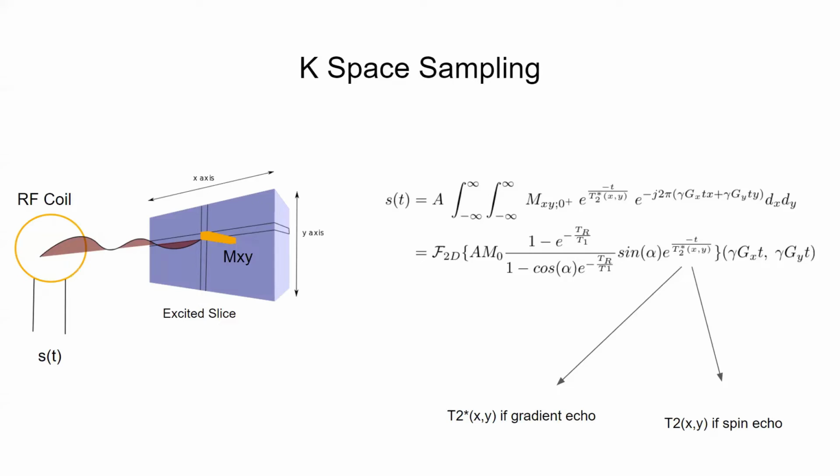For us to simulate this, we have to take the double summation because we are working with discrete elements, and the end formula gives us a nice formula for the k-space sampling. We take the 2D Fourier transform of the signal given in the equation, and as time passes, the points that we sample from k-space change. So this is very convenient.